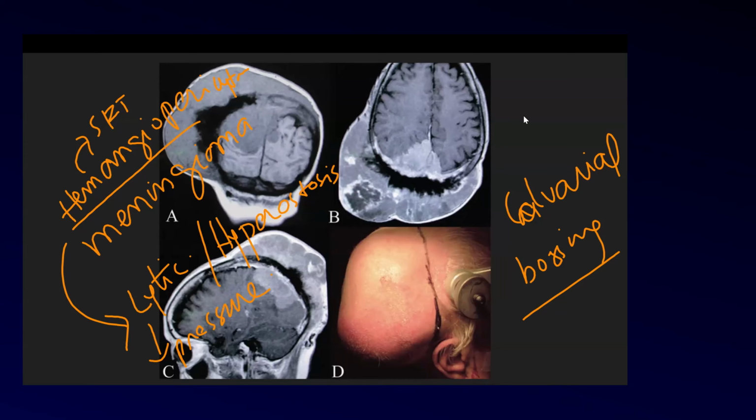There's going to be significant peritumoral edema. And apart from that, you might see some calcifications, but that is an overlapping feature. One feature that will probably alert you to the presence of a solitary fibrous tumor is the osteolytic appearance. It eats up the bone very aggressively.